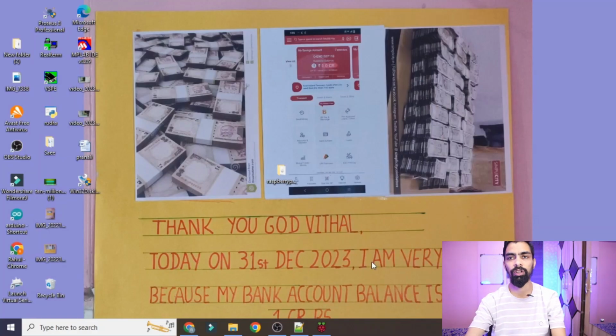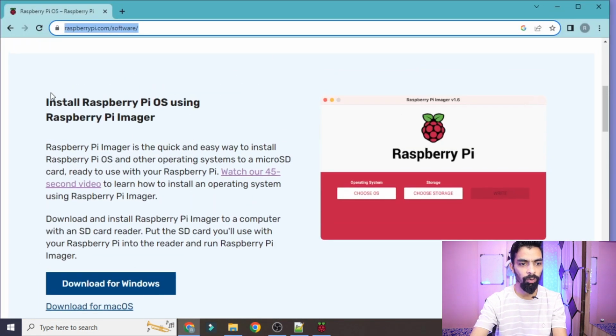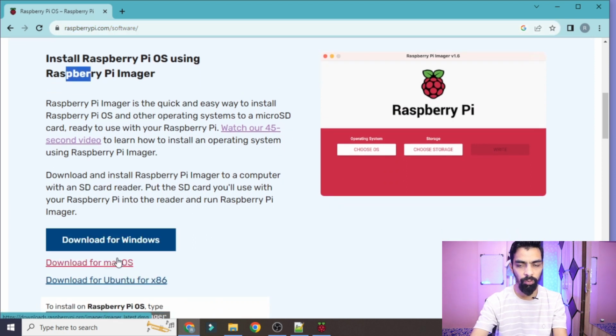Now in the software installation part, it is very important you have the latest Raspberry Pi OS on your memory card. How to install that OS? First you should go to the Raspberry Pi website, raspberrypi.com, and from here you can download the Raspberry Pi Imager software. Click on the version for Windows, or whatever your operating system is. My operating system is Windows, so I click on this one.